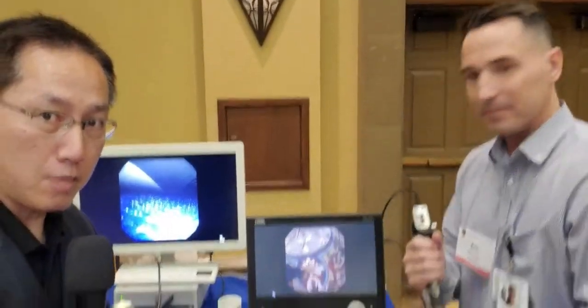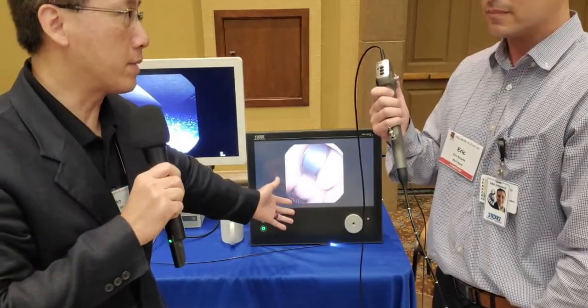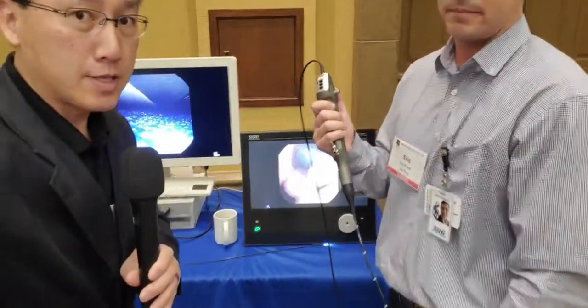I'm going to step aside and show you guys the tele-pack, which is this thing right here. In the OR maybe that could be more applicable, or it could be in the office — you can set this on the tower. The C-Hub is a tiny little box, an interface box that you can plug this cystoscope into. Imagine a scenario where you have the monitor on the wall that articulates out, and then you have the C-Hub behind it and then you connect this flexible scope.